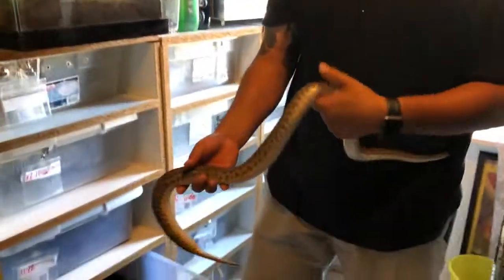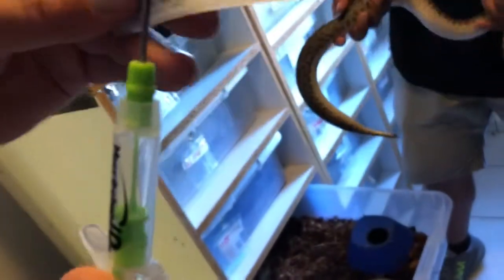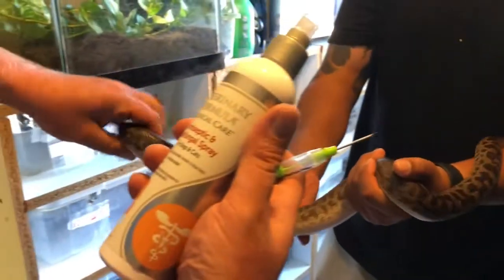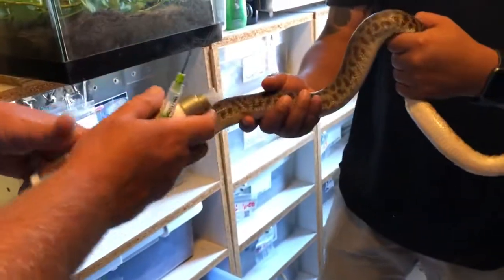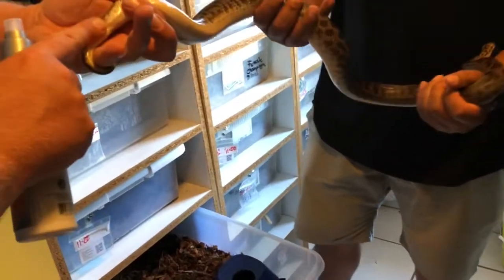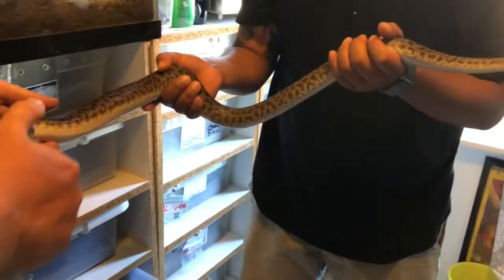Grab the chip — it's still in there, you can see it even though I dropped it. Push it down just a little bit so it's seated in there. We find some antiseptic antifungal spray, then we find the cloaca, which is right here — see this? That's the cloaca.